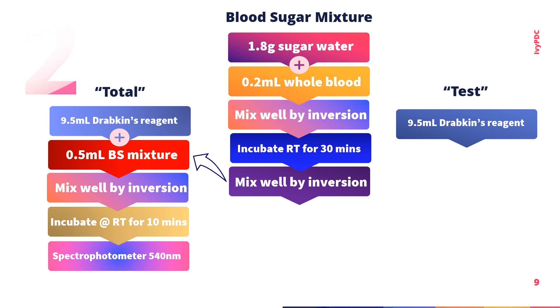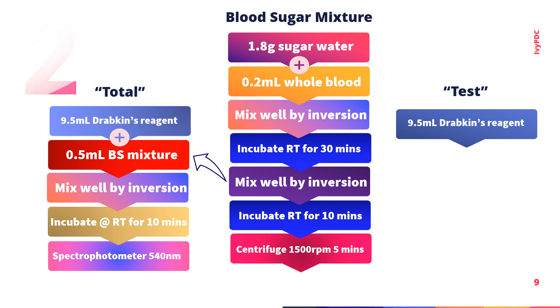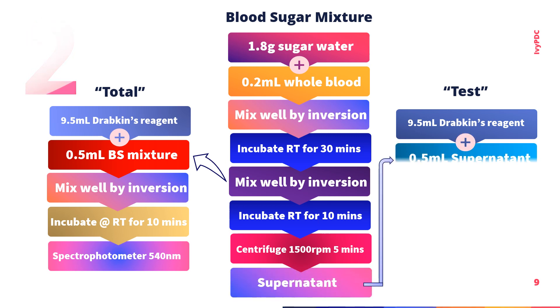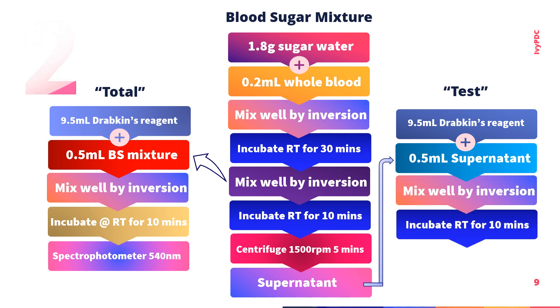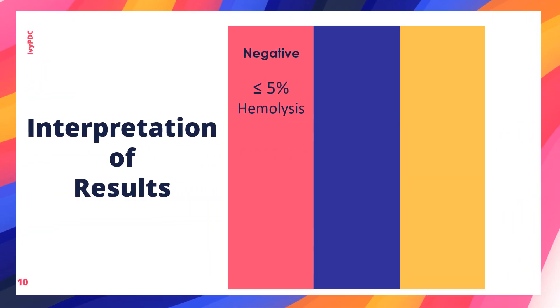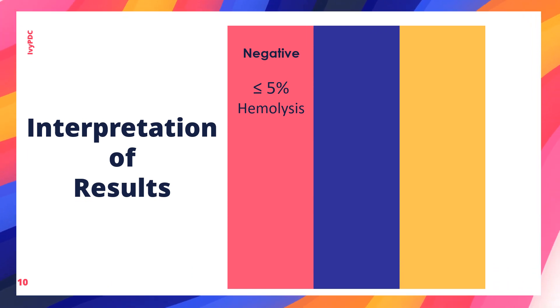Going back to the blood-sugar mixture, after transferring for the 'total' tube, incubate again at room temperature for 10 minutes. After 10 minutes, centrifuge for 5 minutes at 1500 rpm. Transfer the supernatant to the test tube labeled 'test,' mix properly, and incubate at room temperature for 10 minutes. After 10 minutes, read using the spectrophotometer.